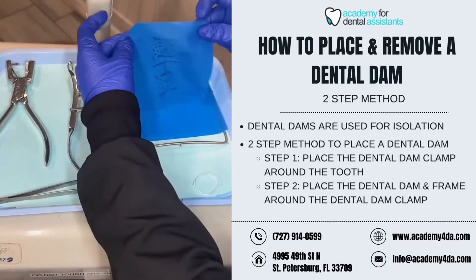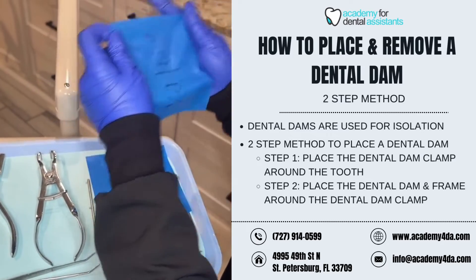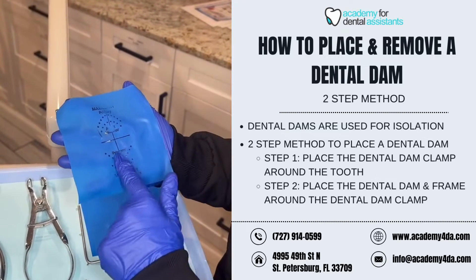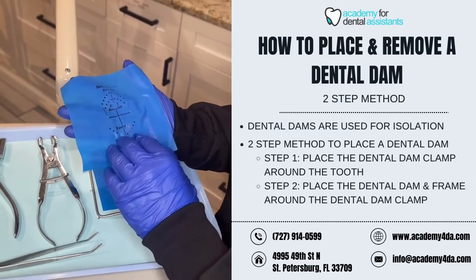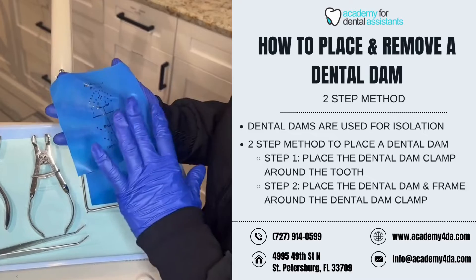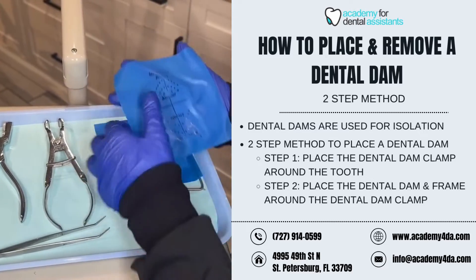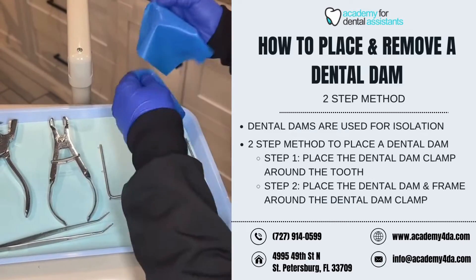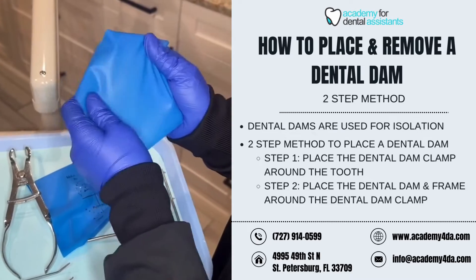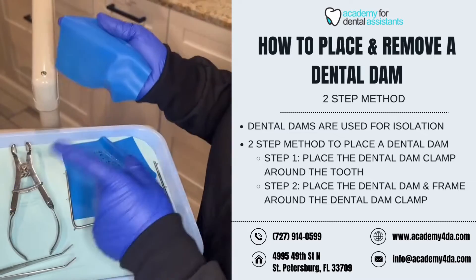Next I'm going to use my dental dam. This is a pre-stamped one so I can see roughly where I need to punch my hole depending on the tooth I'm working on. Dental dams are used for isolating a tooth, a few teeth, a quadrant — whatever the dentist's preference is — but they're mainly used for isolation. In this instance I'm using tooth number 28. I already have my hole stamped and punched into the dental dam. For another example of how to do that, go ahead and watch the one-step video.